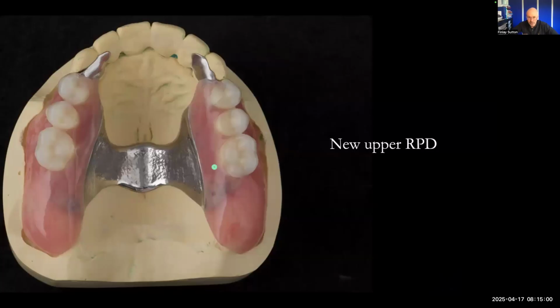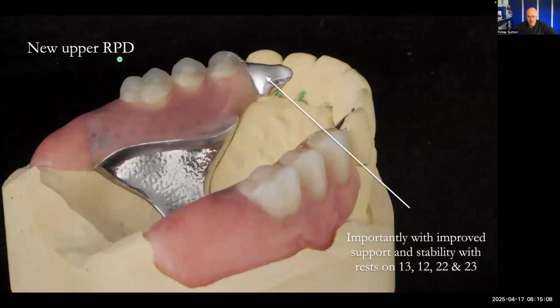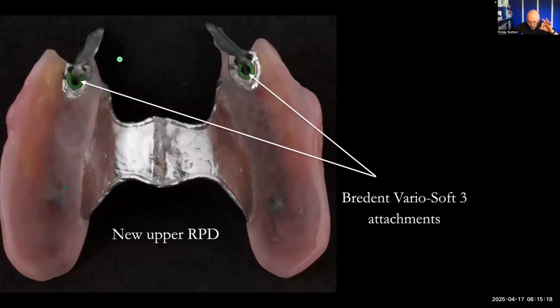But anyway, let's just look at the upper here. I do think these little features are so important. Having bracing elements on this upper, just to resist rotational forces, increases stability and puts less pressure on that cantilever section. So important with this there. So it's got this attachment in.